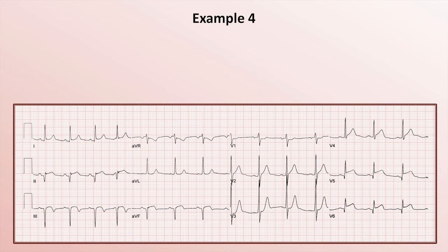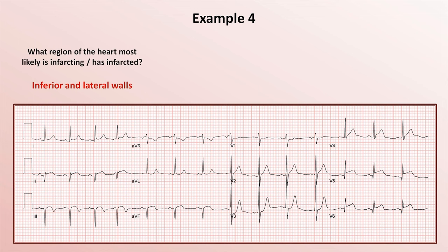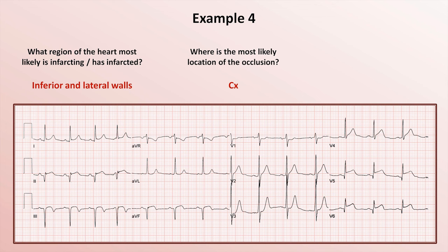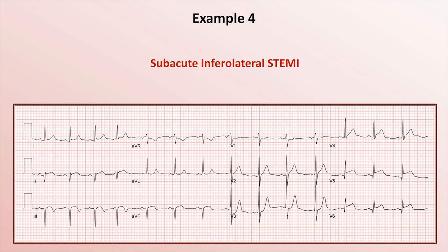In example 4, we see ST elevations in 2, 3, and AVF as well as in V5 and V6, so both the inferior and lateral walls are involved. Unlike prior examples where we couldn't localize the inferior wall occlusion to a single vascular territory, the combination of inferior with lateral involvement makes it highly probable that this patient has a circumflex occlusion in a left dominant circulation. We again see both Q-waves and ST elevations in the inferior leads, meaning the infarct is hours to days old. Summary: this is a subacute inferolateral STEMI.